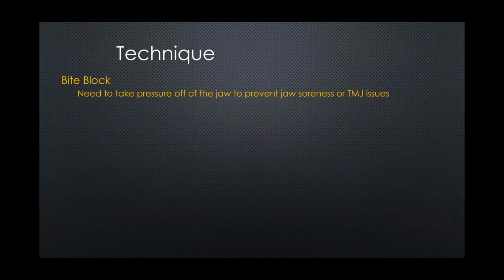Also think in terms of, okay, what happens if? What happens if I'm taking this tooth out and it might do this? What happens if I'm taking the tooth out and it might start to bleed? Think about all these what ifs. It just makes you a better surgeon. Okay, bite block.